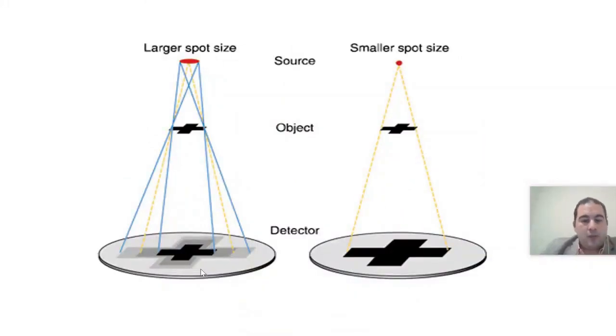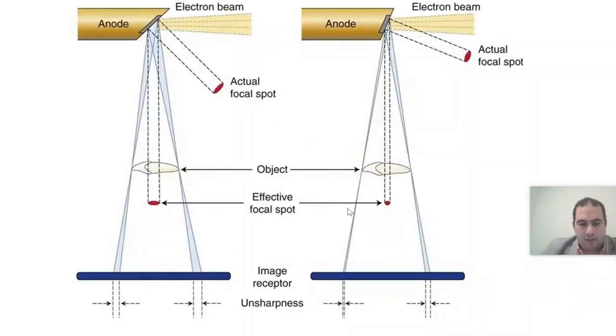Here, this is also the blurring effect that occurs with the large spot size at the same distance from the object that is present. Please, go ahead. We just said the O.